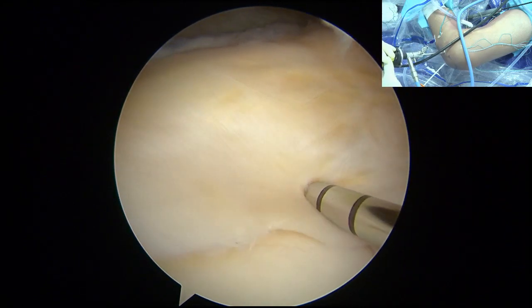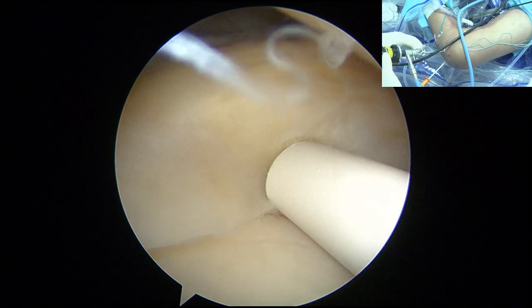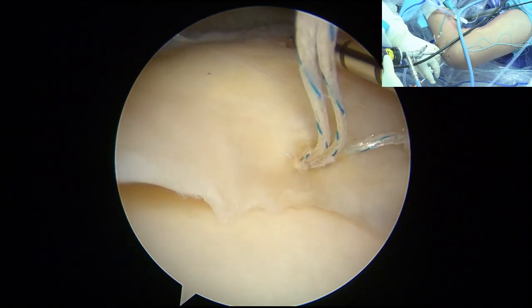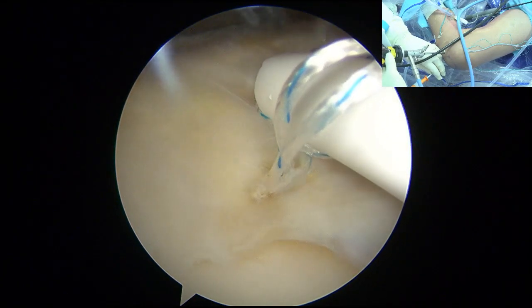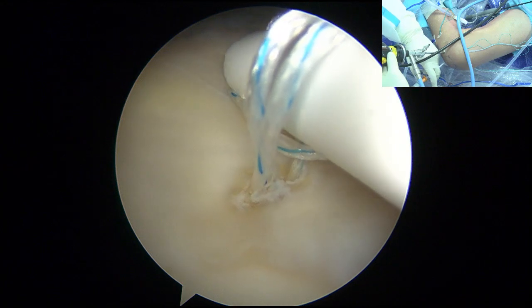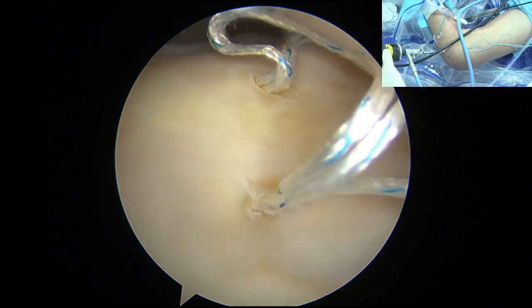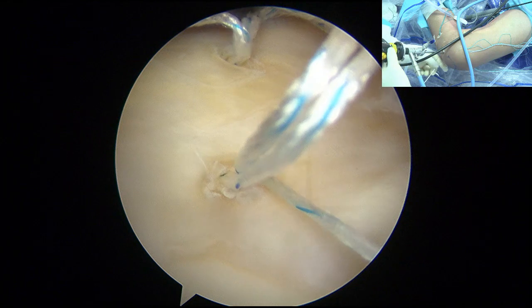So we repair this area again, upper surface. Repair, okay. You go in and you turn this way, okay? Kick. Okay, that's nice. Nice shoot. Okay, we try to go this way. But sometimes after you release the posterior capsule, the meniscus can be easily pulled out. So we have to be careful in patients that also have PCL and lateral meniscus. When you put the anchor, sometimes the anchor needs to sit on the capsule, right? The meniscal capsule. It can easily pull out. Careful.